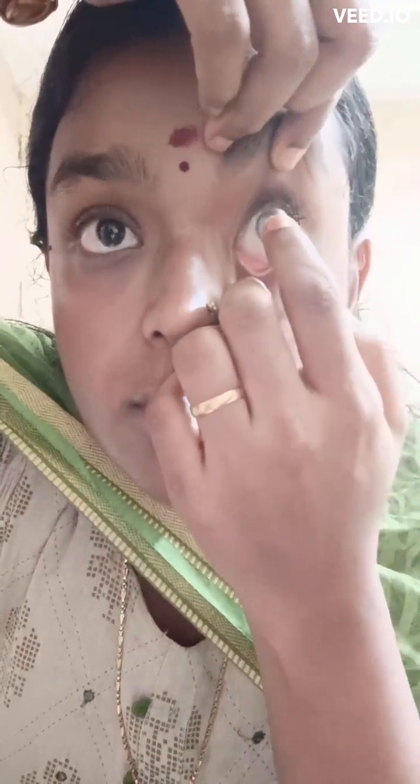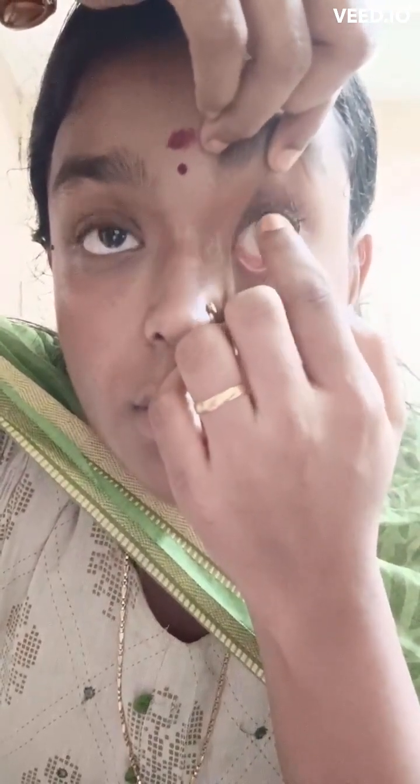This is the upright position — hope it is visible. We have to ask the patient to look directly straight. We have to use our middle finger to pull the patient's lower eyelid down, and hold the upper eyelid, and then insert the contact lens.